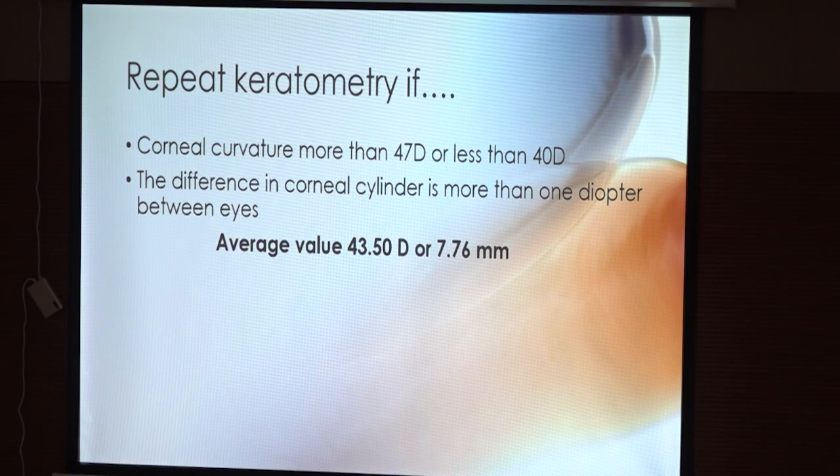We should repeat a keratometry if corneal curvature is more than 47 or less than 40 diopters, and the difference between the corneal cylinders is more than 1 diopter between the 2 eyes.